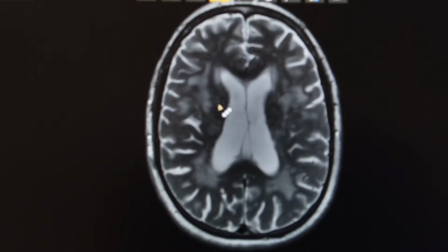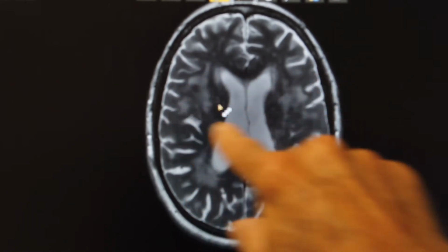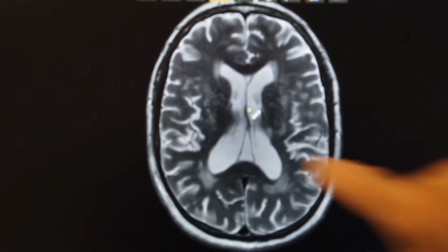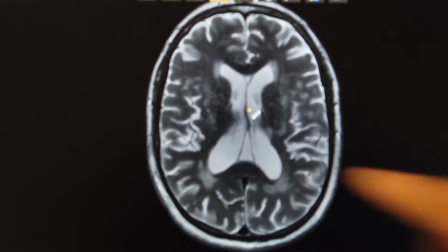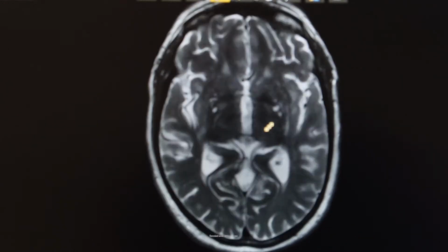And we look around a little bit more. Here's pretty much the same image, this white stuff in here, this flocculent or kind of cottony swirls of stuff, shows changes. These little dots in here, this is ischemic changes. This white part over here and here shouldn't be here. And we look in a variety of other areas.